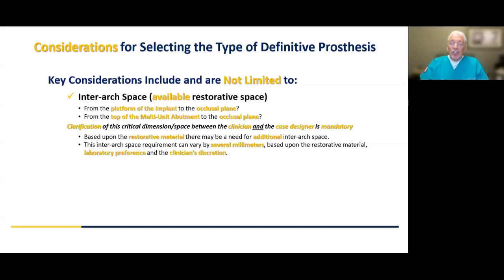But it could be your choice, doctor, to say, well, I'm not comfortable removing that much alveolar bone. If I feel I can't open the vertical any more than what I've done, and the laboratory is telling me, based on the scans, the CT, and all the criteria that's out there, that I need this much bone reduction, 7 millimeters or 5 millimeters of alveolar reduction, I don't want to do that.